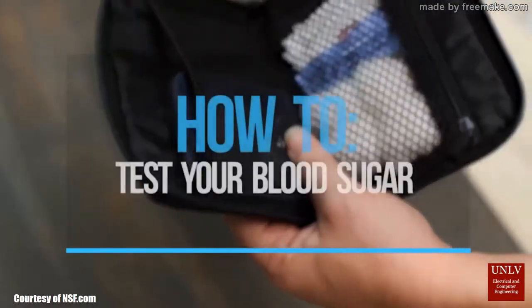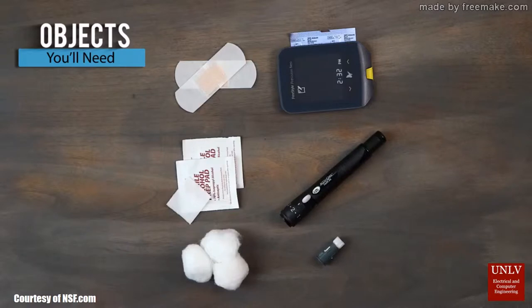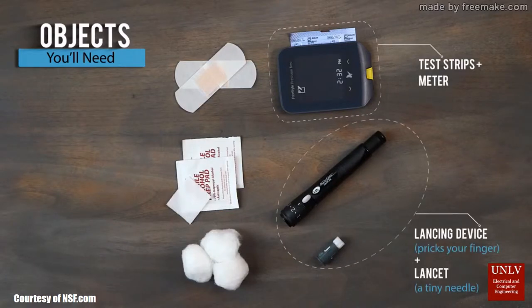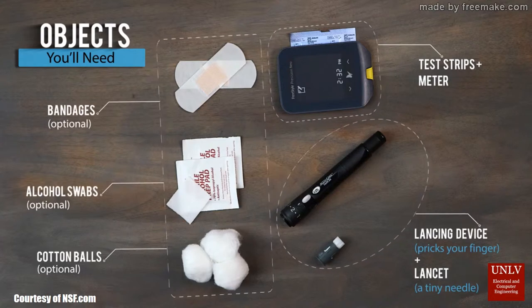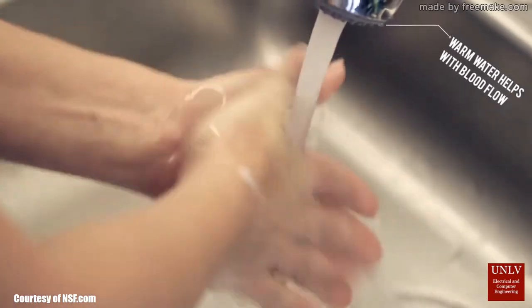As we can appreciate in the animation provided by our friends at NSF, traditional testing methods require multiple steps to follow, without mentioning the amount of equipment that a person has to carry around on an everyday basis.